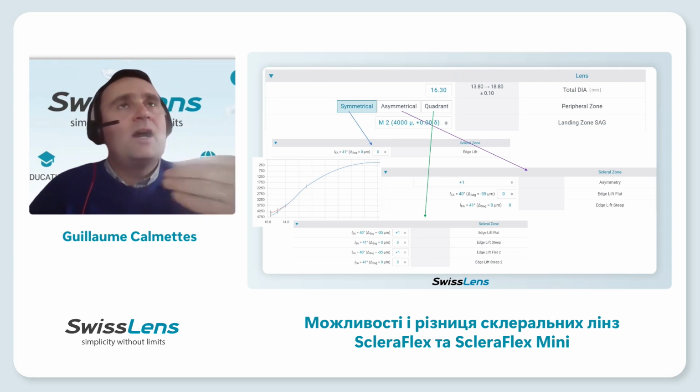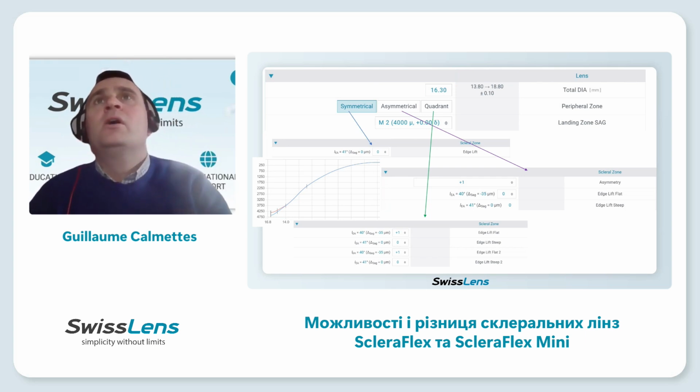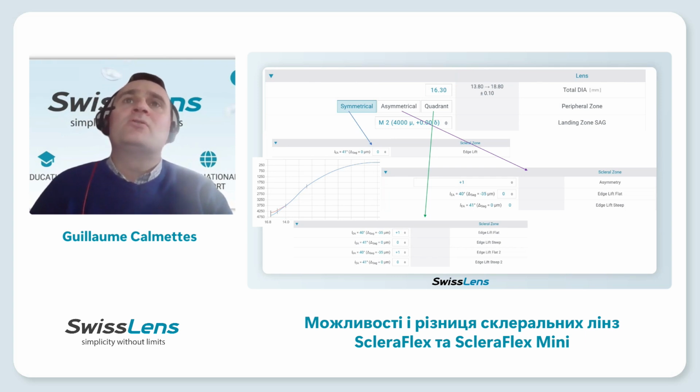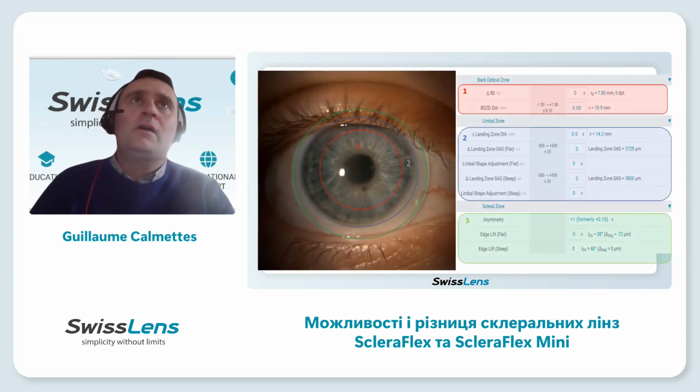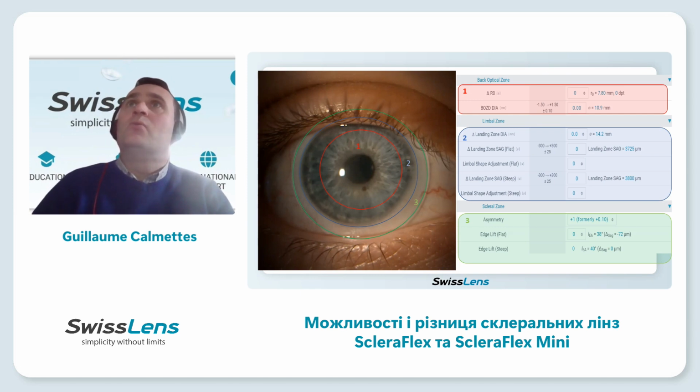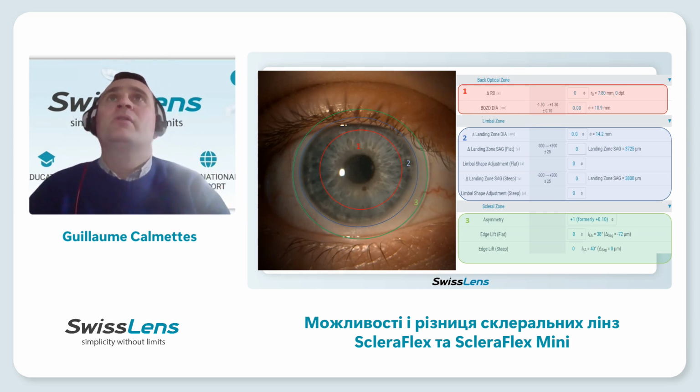It's there to help you start. But now we are not starting. We now have a scleral lens with a little bit more options to fit a more complicated eye. The problem is we need to speak the same language together. So in this slide, you can see which zone and which parameter we are working on.